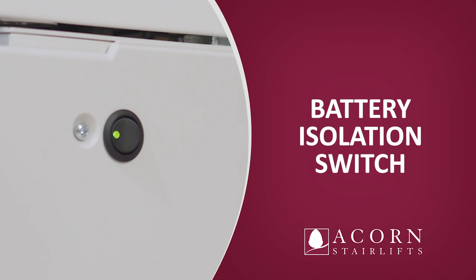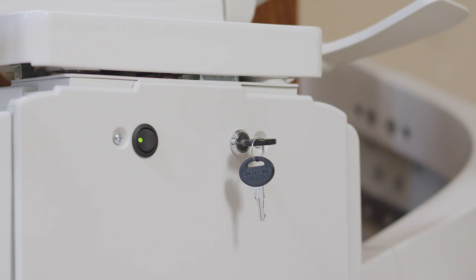Battery isolation switch. The battery isolation switch can be found under the seat to the left of the key. The switch should remain on at all times. Failing to do so will result in the batteries losing their charge and will not be covered under the warranty terms and conditions.